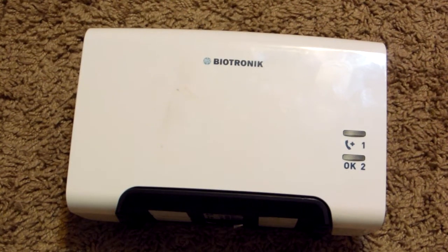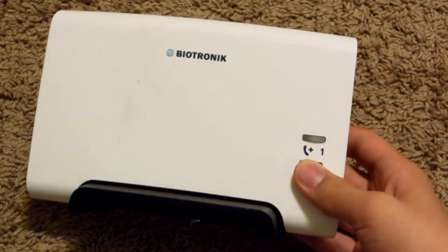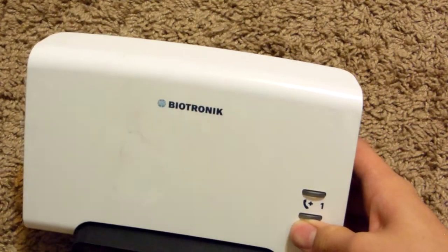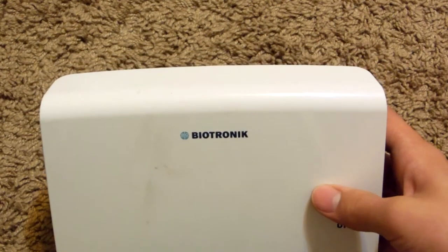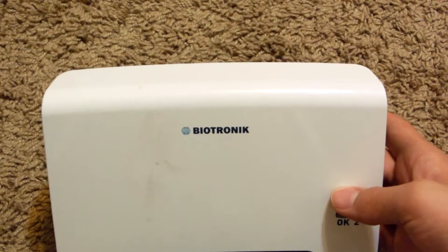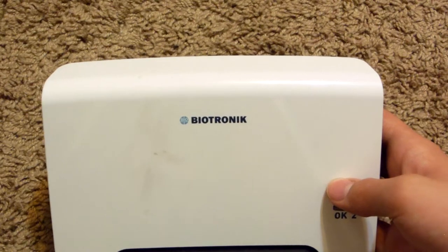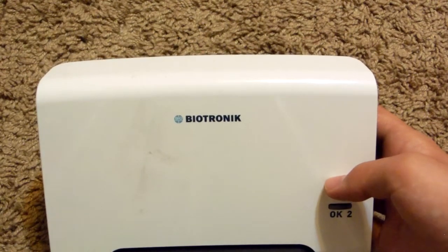Hello everyone. In this video I'll show you guys what's inside this Biotronik Cardio Messenger. This device is used for people that have pacemakers, and what it does is send a signal to both the pacemaker and the hospital. It basically alerts them of any problems and allows people to get medical service faster, as well as schedule appointments and other various things. So it's a really cool device.